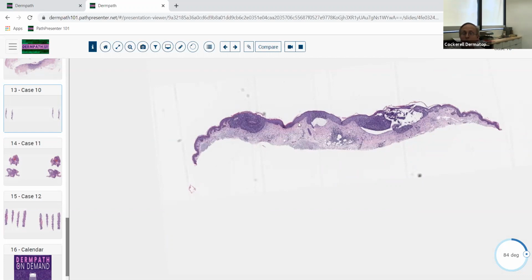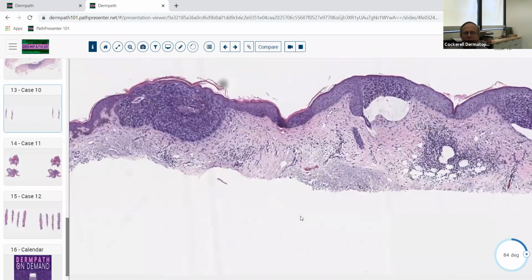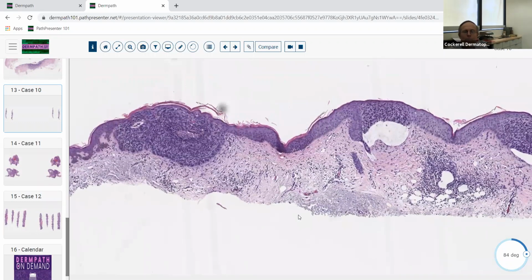So you might see a little new aggregation of the carcinoma occurring over here if you did a larger biopsy. So we get a lot of requests for margins on cancers with biopsies. I'm not a big fan of that. It's okay, we give it when the clinicians ask for it, but I would never rest my hat on that 100%, because you just don't really know for sure that, just because it wasn't in the plane of section, that maybe there's cancer either outside the plane of section that we're looking at, or that you just didn't sample it.